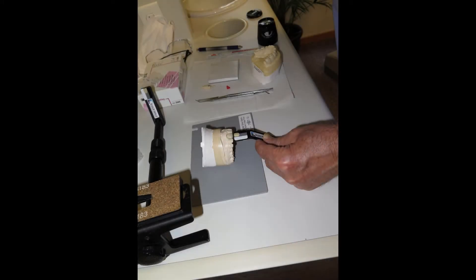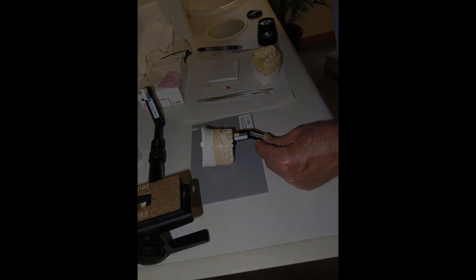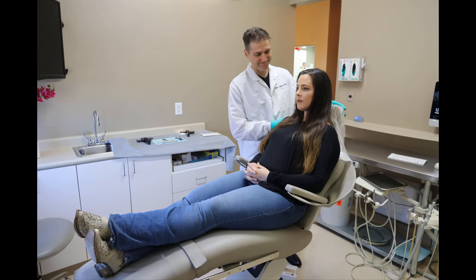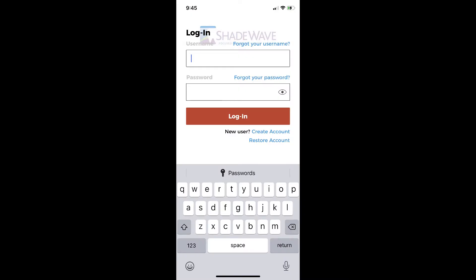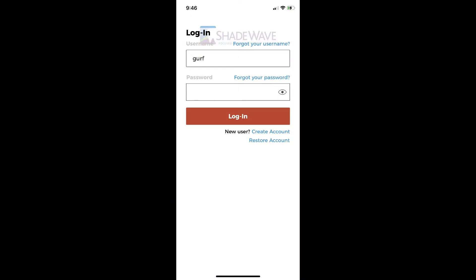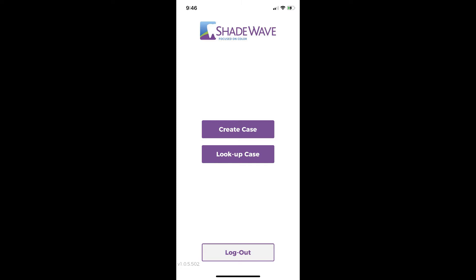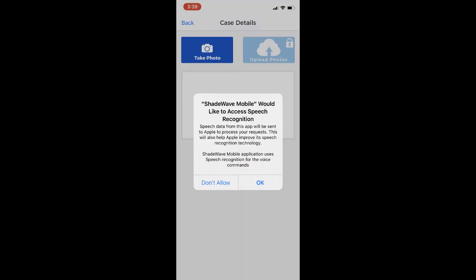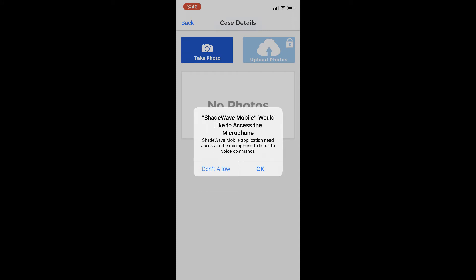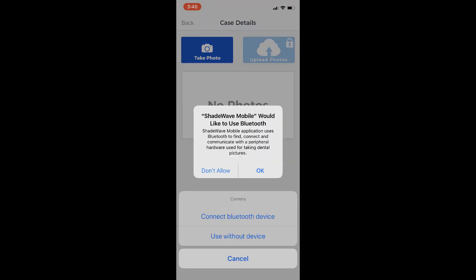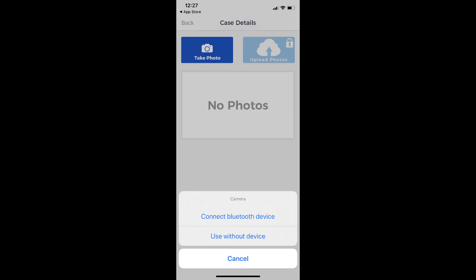Ideally the next steps should be done wherever you take your photos — usually in the shade room if you're a lab professional, or the operatory if you're a dentist. Open the app, log in, and create a case. Approve the one-time setup procedures for speech recognition and microphone, then select Take Photo, click OK on using Bluetooth, and then choose Use Without Device.